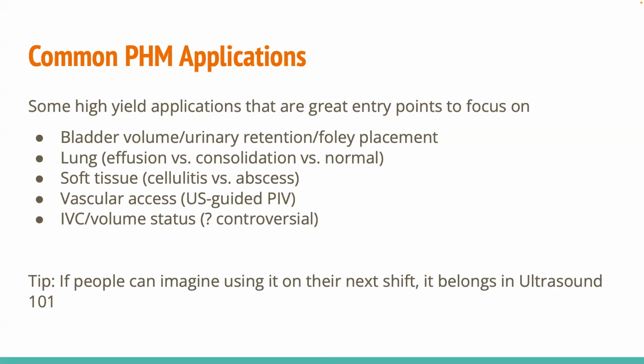So you're not doing cardiac, you're not doing intussusception, you're not doing an appendix ultrasound. You want something that is easy to replicate, has a low barrier to physically manipulating the probe, as well as understanding the basics of ultrasound itself.